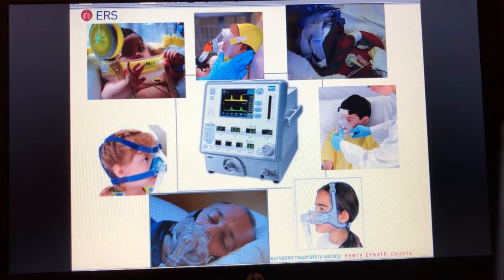which interestingly has an extremely clever piece of contraption in it which reduces the amount of flow into the nose when the baby's breathing out, which for premature babies is particularly important, because you remember earlier we said that immature lungs have fewer diaphragm units which are resistant to fatigue, and that's particularly true for infants.